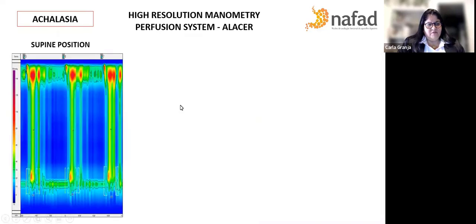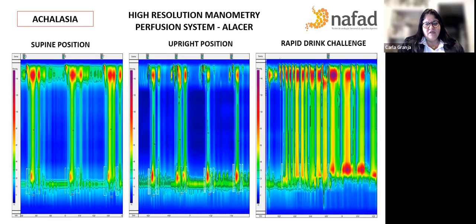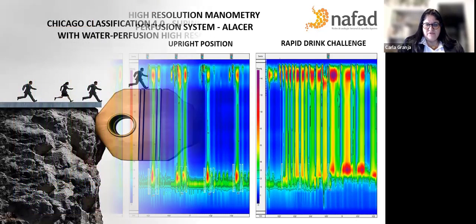In a patient with achalasia, we have pan-pressurization in supine position. Then it's the same thing that we see in the upright position, the alteration of the IRP over 16 and the pan-pressurization documented. And here is the image of the worse pressurization with a bigger volume of water in rapid drink challenge.